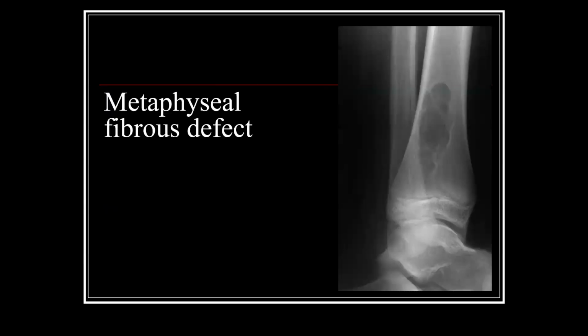So here's a radiographic example showing the lytic component of this, sclerotic margin, and a slight extension up here towards the diaphysis. Here we see what this looks like histologically, very bland cytology, no ossification, occasionally some foamy histiocytes and rare giant cells to this lesion.